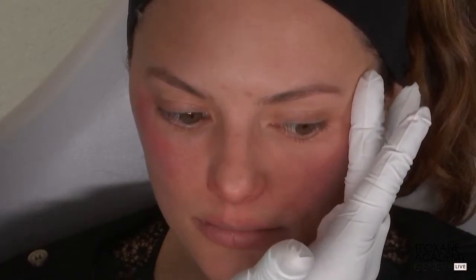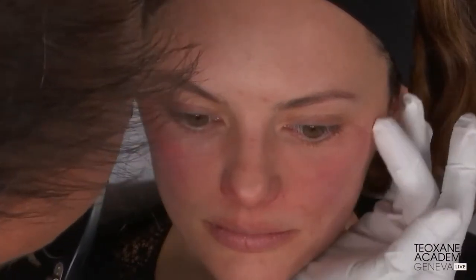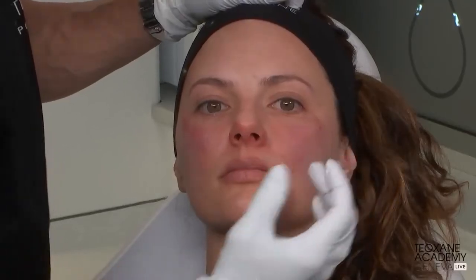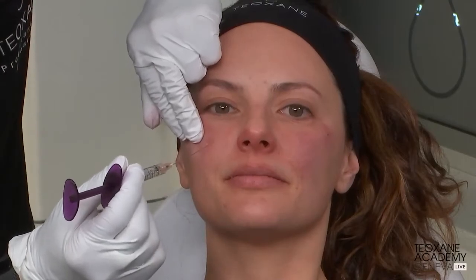So I would use the same technique, but instead of projecting the zygomatic arch high as in a female, to give her a cat eye look, I would stay a little lower and project a little more laterally here to give a more masculine, Viking look, if you will. And the beauty is, since we have a few minutes left, I usually finish up the treatment for the G-point.